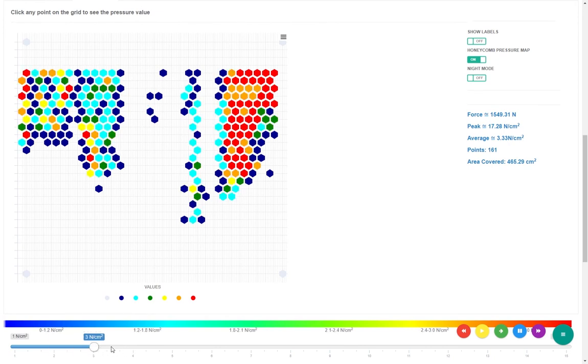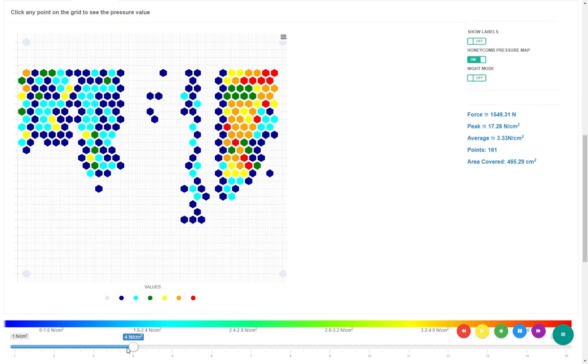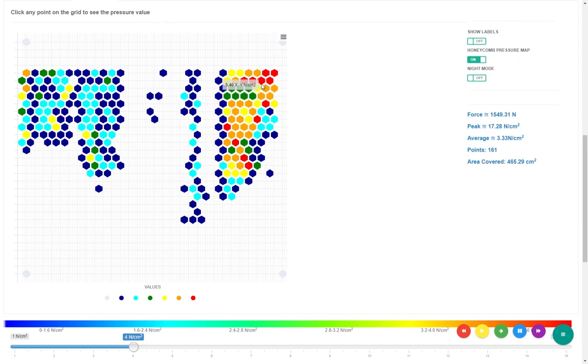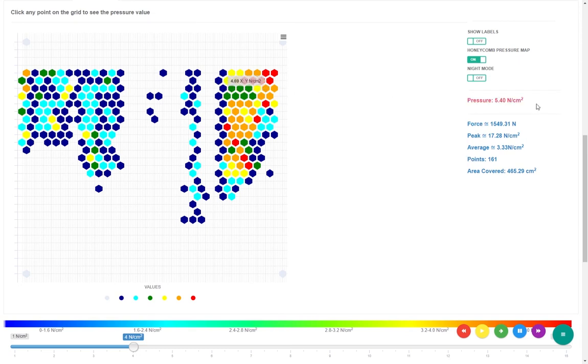Here, the slider at the bottom is the max pressure threshold. If the pressure exceeds this, then it will be marked red. Similarly, if the pressure is insignificant, then it will be marked light blue.